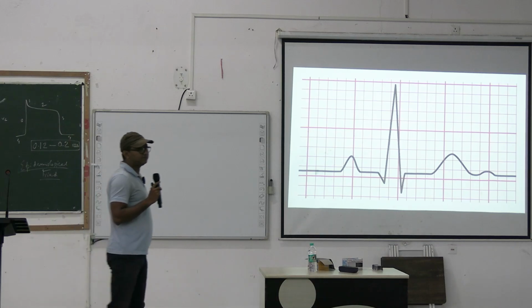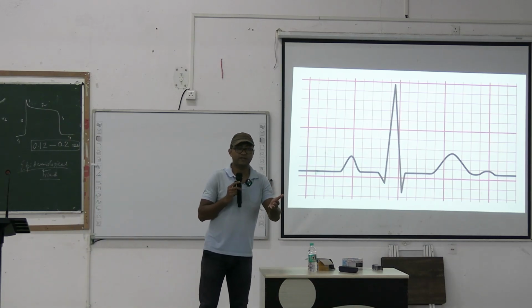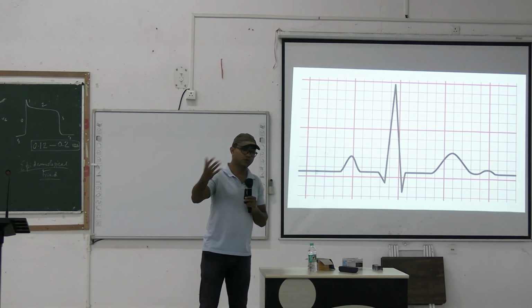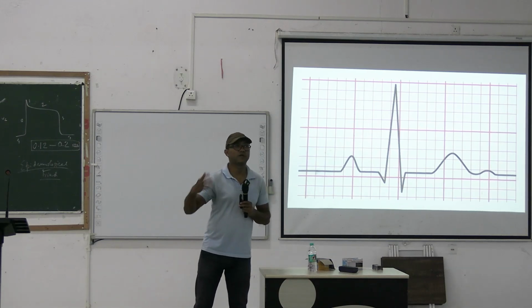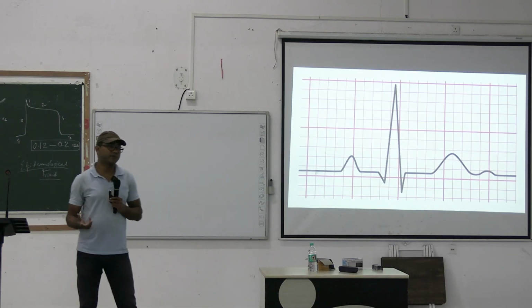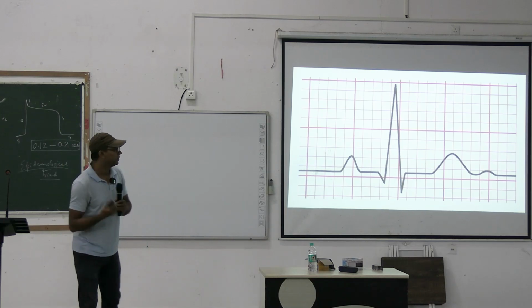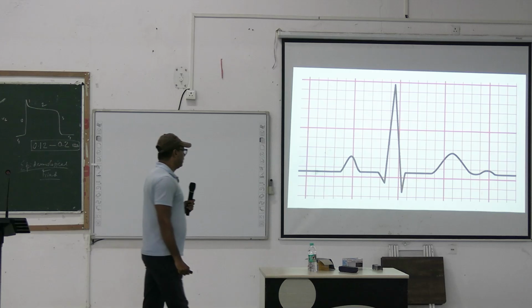Clear? In a computerized ECG, everything will be written. We can calculate 120 millisecond, 80 millisecond, but in a computerized ECG, the computer can also calculate 119 millisecond, 117 millisecond. That is impossible to calculate manually, right. So, you will get the exact QRS duration from the software of the computerized ECG. Okay, we will show this in your practical classes.